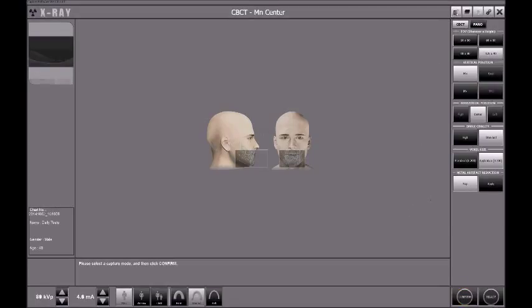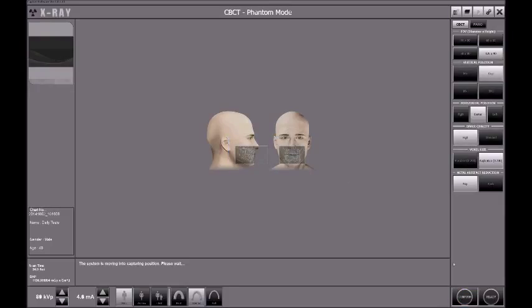After you evaluate your region of interest, just take a screenshot as I just did, to save it into your imaging software. Then we are ready to take another X-ray, in this case to evaluate uniformity.